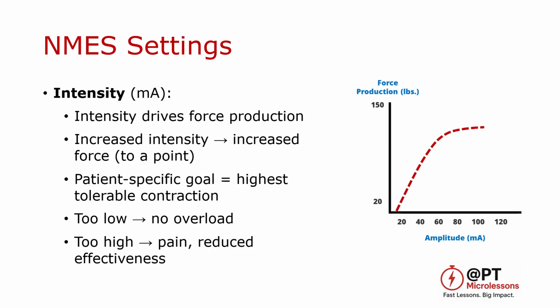Let's take a look at intensity, or amplitude. It is a key driver of force production with NMES.